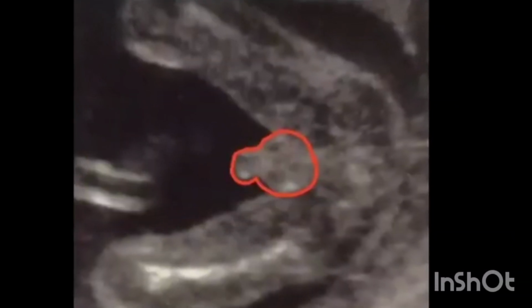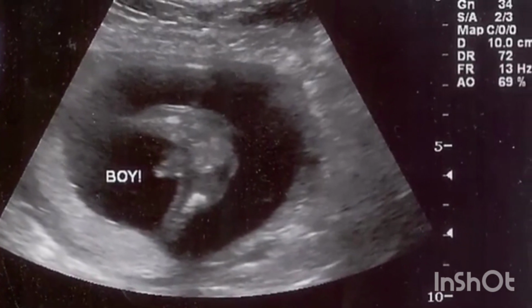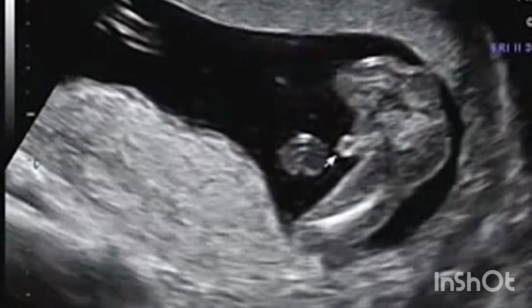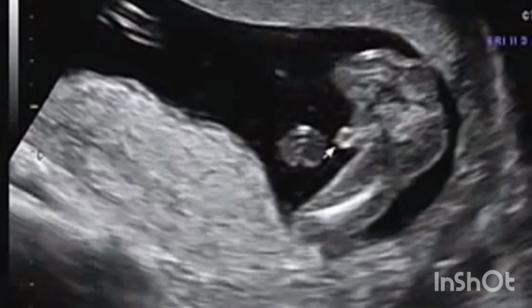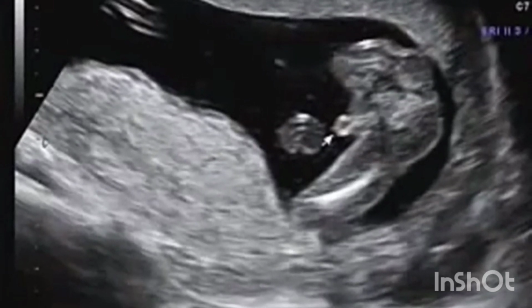Try it. Baby boy ultrasound signs. Flow of urine: the flow of urine can sometimes be spotted in a fetus. If it is moving upward, then it is more likely a boy. Male genitalia: often seen by weeks 18 to 20, the presence of male genitalia, including testicles, scrotum, and penis, is a clear sign of male sex. The scrotal sac and the penis are the basic signals of identifying a baby boy, used in 90% of cases.